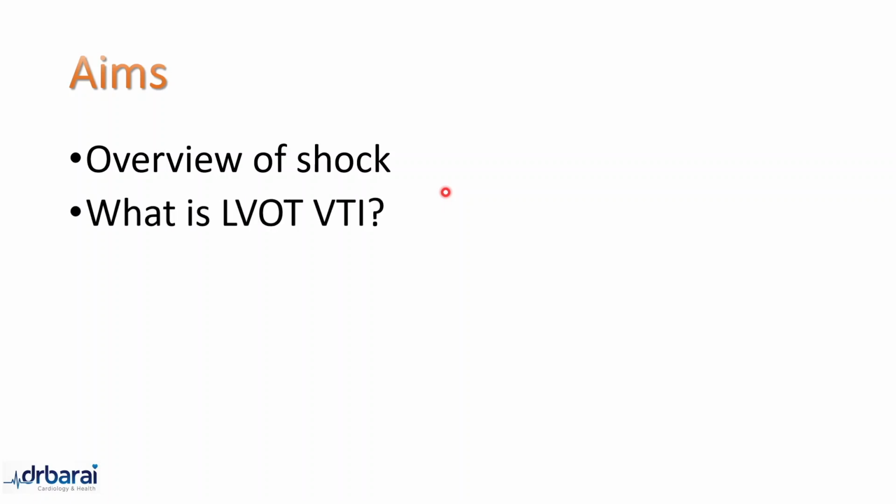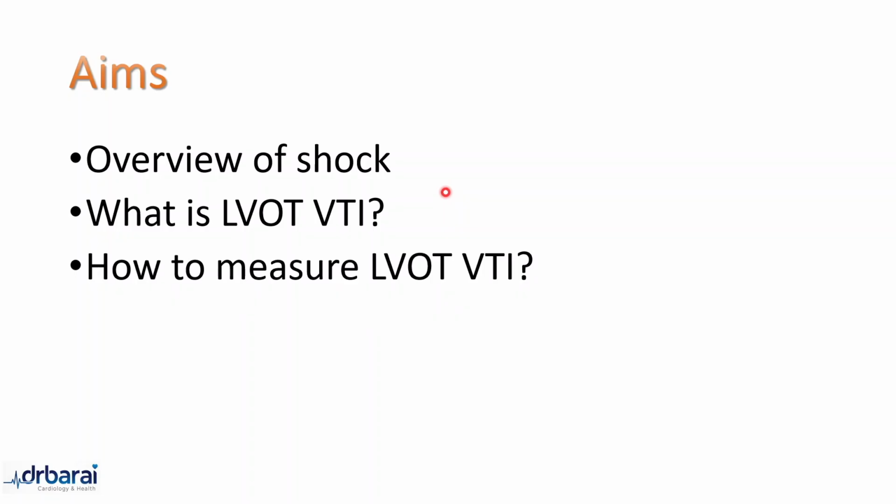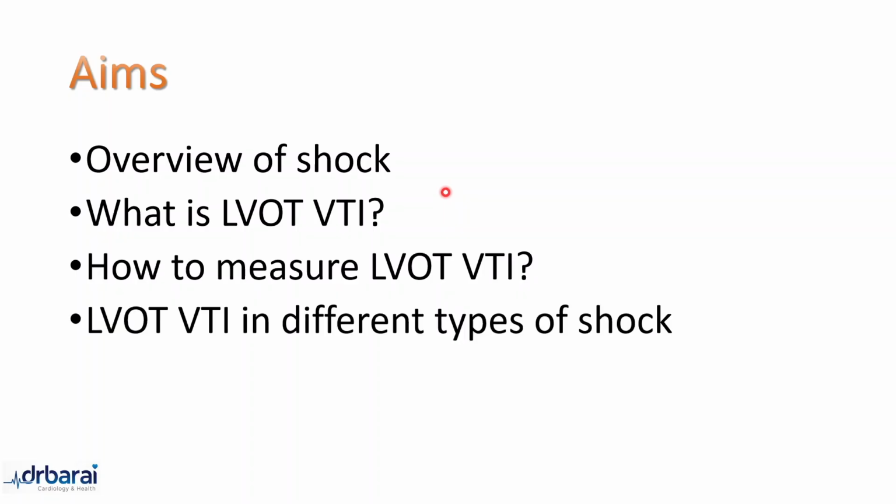So this is what we'll do over the next 30 minutes. First of all, we'll talk about what is shock. What is the basics about shock? What are the different types of shock? How do they present? And why we should need to know about the LVOT VTI. We'll talk about what LVOT VTI is all about, how to measure them is very important, and of course the most important thing is how we can apply this LVOT VTI in different types of shock in their assessment as well as in their management.